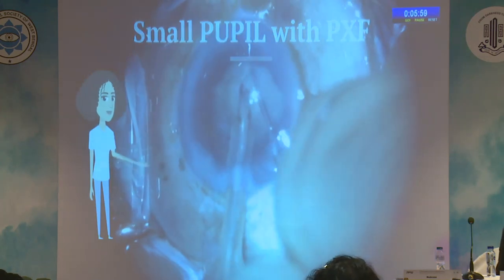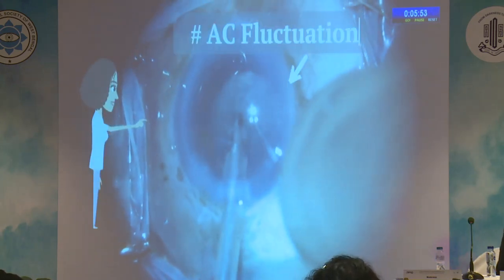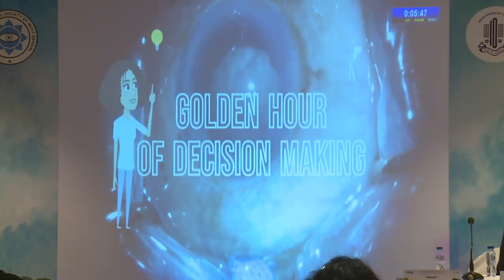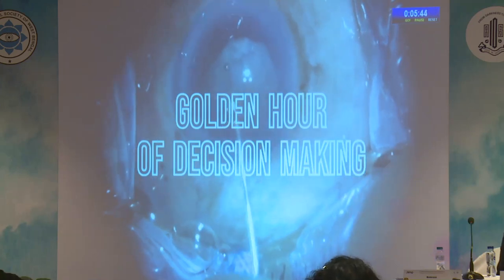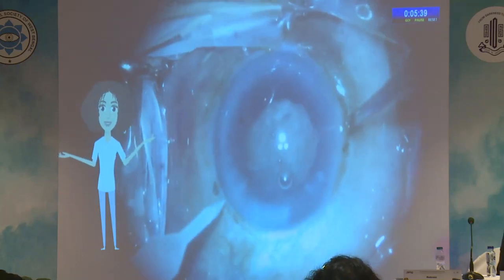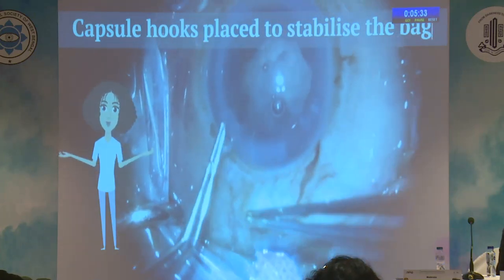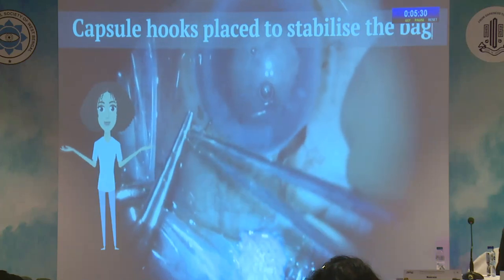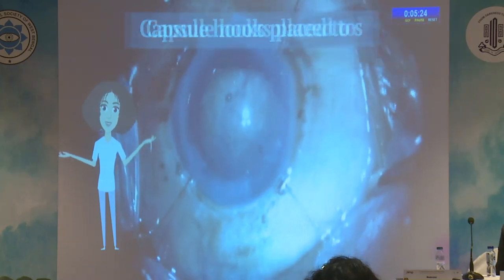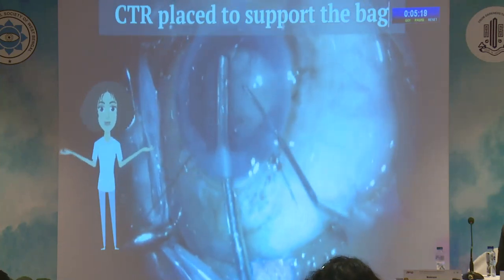In this first case of a small pupil with dense pseudoexfoliation, after his first chop, the surgeon notices a sudden fluctuation in the anterior chamber depth. At this critical moment of decision making, the golden hour, he promptly decides to place capsule hooks. He makes 4 paracenteses and places the capsule hooks to stabilize the bag. He also injects a CTR for further supporting the bag.